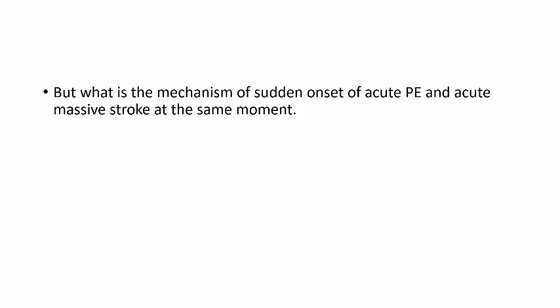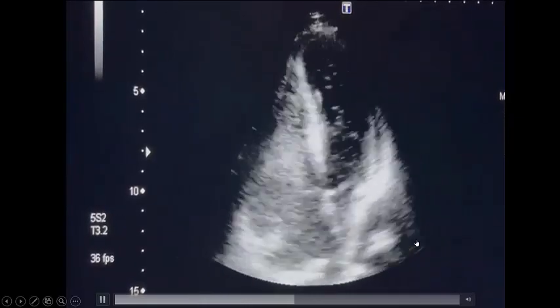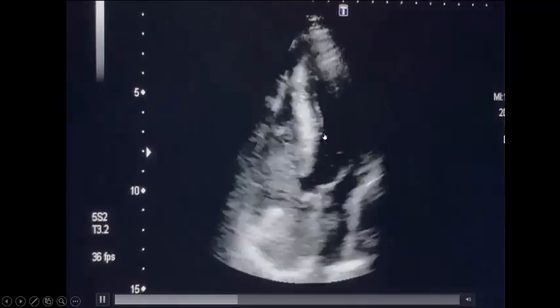It's not a watershed infarction, because watershed infarction will not cause arrested flow in the left middle and anterior cerebral artery. It is stroke. But what's the mechanism of stroke? You need to do a bubble test at midnight. Very easy. Flush the agitated saline.